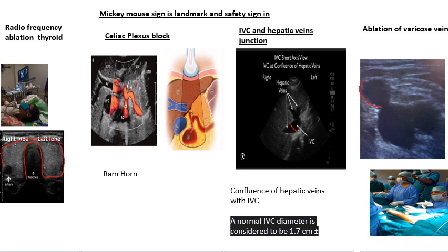You see, this is the femoral artery, and then you have the femoral vein, and you have the saphenous vein. Now, one of these structures naturally will pulsate. So you will know that is the artery, and the other one is the saphenous vein, not the femoral vein. This will be huge. This is the femoral vein.